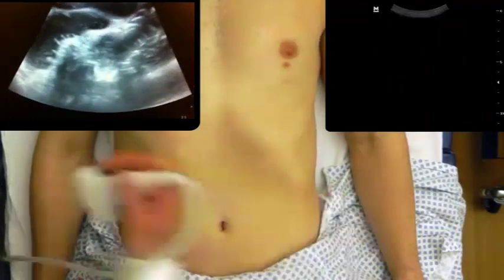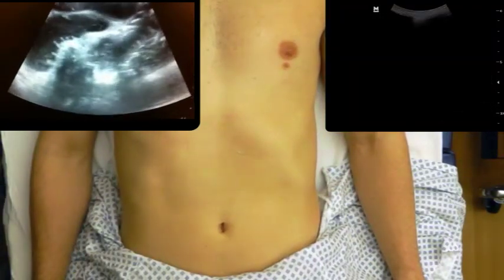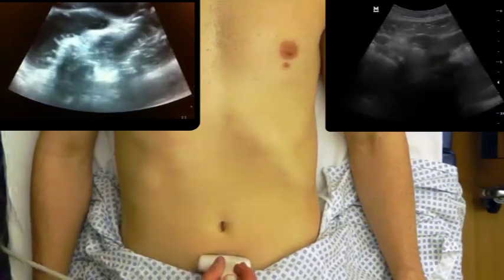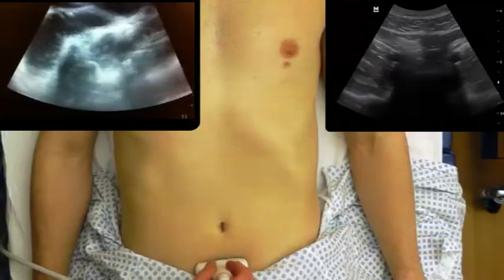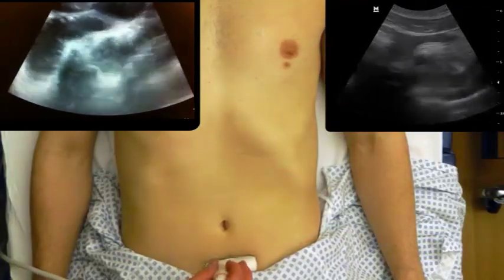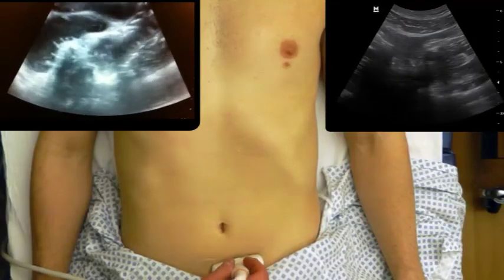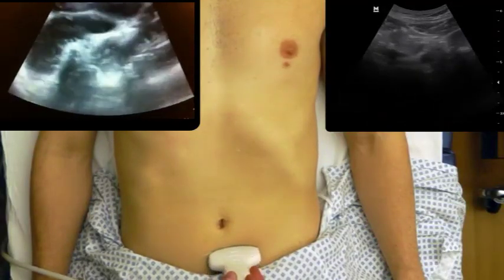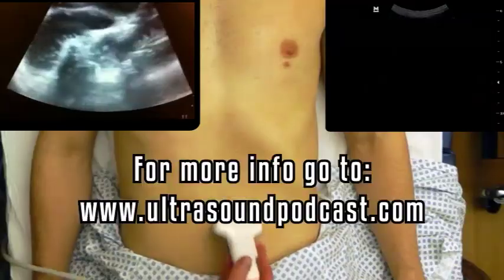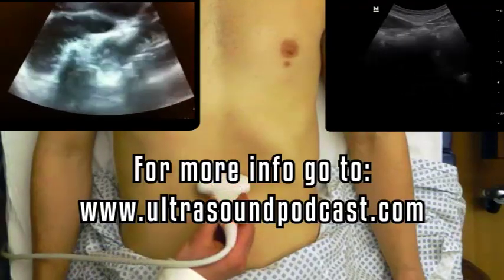Finally, after looking more posteriorly, I will come back again and look suprapubically on the patient's abdomen to ensure that I don't see any fluid-filled loops of bowel there. Again, loops that are greater than 2.5 centimeters, if you see multiple of them, and if there's peristalsis, these are concerning findings for small bowel obstruction.